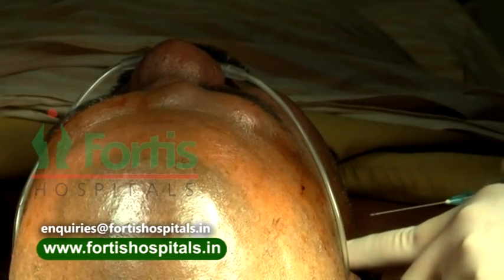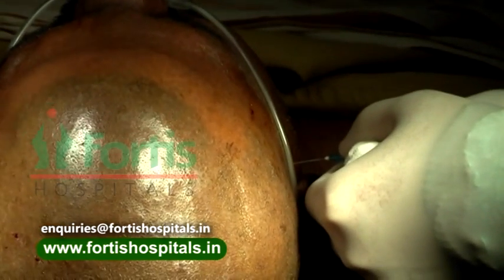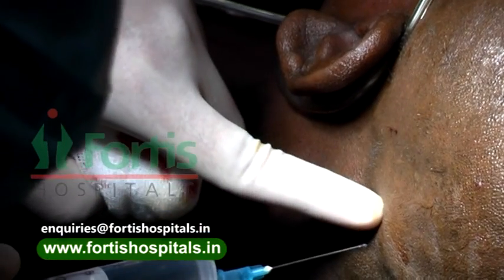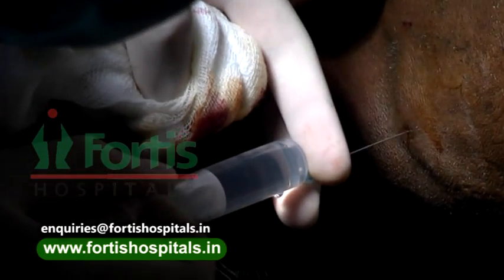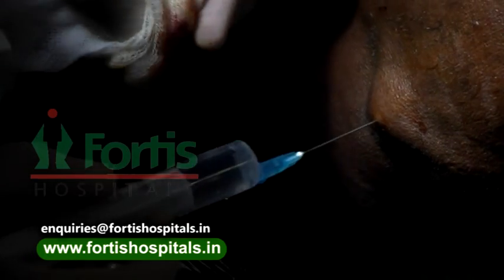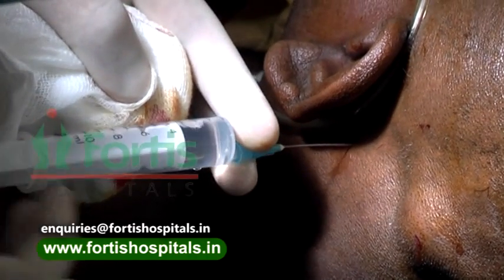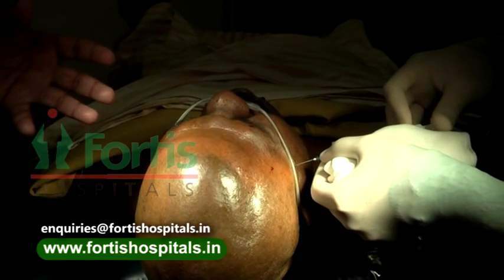The next structure we need to anesthetize is the dura. As we proceed, you will see how we desensitize the dura. Once the dura is desensitized, there is no pain-sensitive structure inside it — as you know, the brain itself is not sensitive to pain. The patient is very much conscious, receiving oxygen through nasal prongs. This is the only part of the procedure which is painful, like any other surgery done under local or regional anesthesia, until the anesthetic agent starts acting.